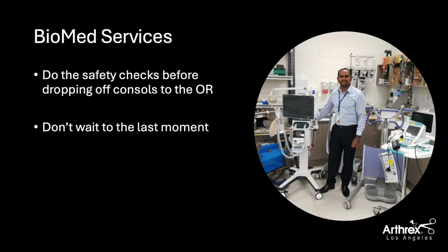When going to these accounts, sometimes with the energy consoles as well as the drill consoles, you need to go to Biomed. With that being said, we do that sometimes a couple days before due to getting an appointment or having to plug it in and signing off on it before your case.